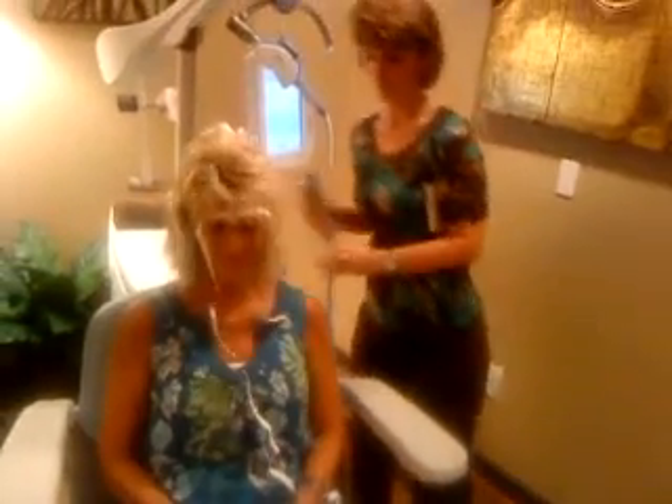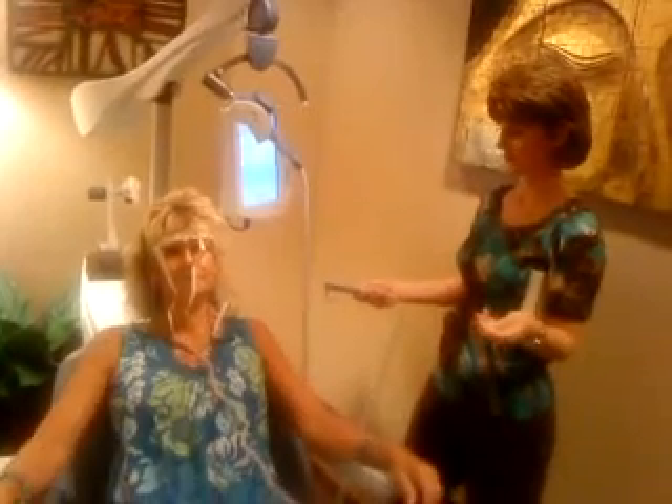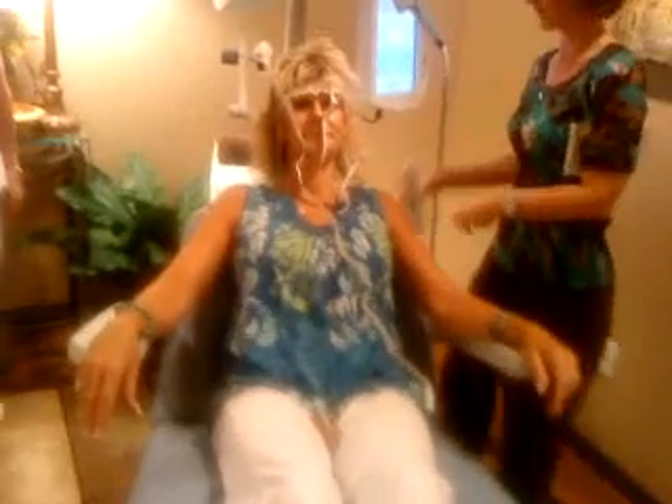We put earplugs in, but I'm not having Roxanna put the earplugs in today. Once we get patients seated comfortably, then we have them go back into treatment position — their legs go up and they're leaning back.